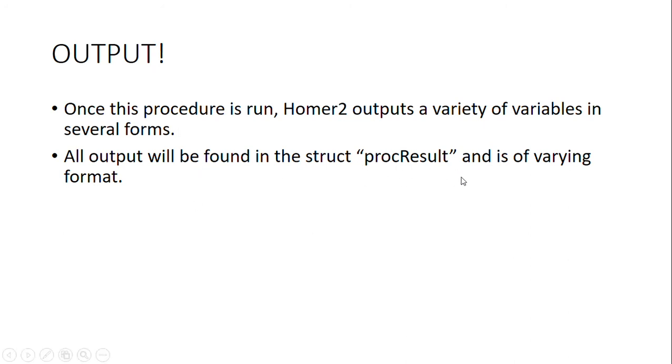If you don't have some of the output, there's a chance that some of your input was missing. If that's the case, I would suggest putting a MATLAB stop sign on one of the lines of code, or even the last line of code, in this function, and you can scroll through the variables to see whether everything is there or not.